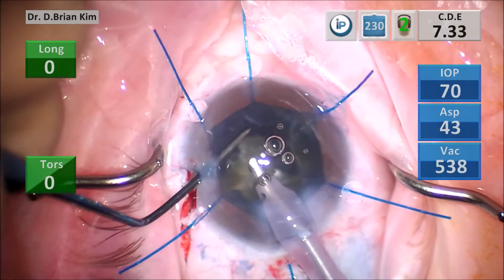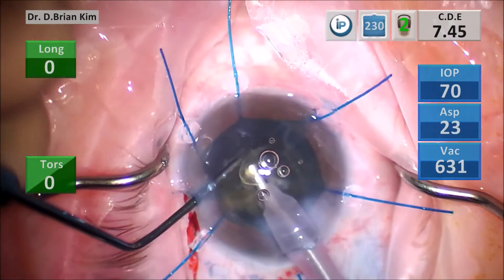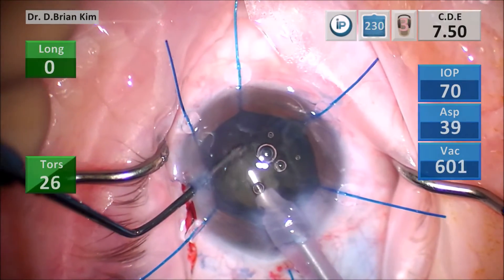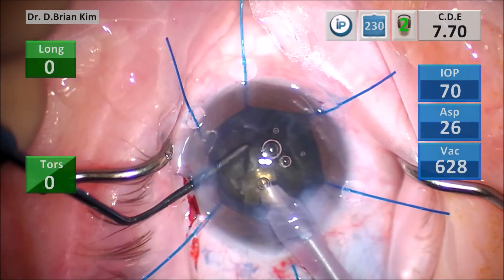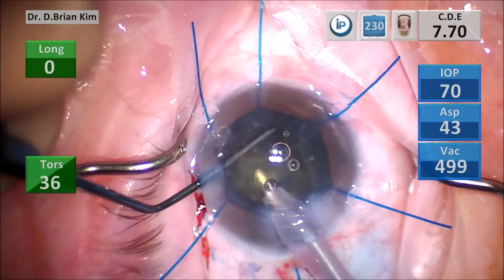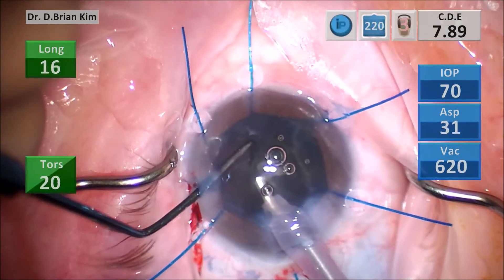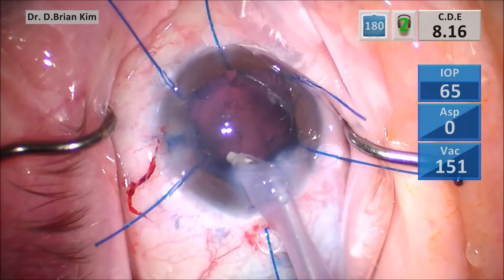I'm turning the chopper sideways, going deeper, and pushing the phaco tip down to meet the chopper. This is a diagonal chop maneuver to give myself some support so that the lens material doesn't fall posteriorly — almost like a reverse chop.